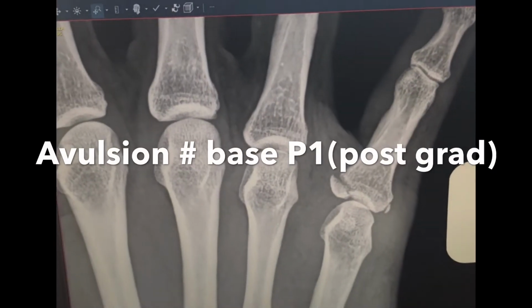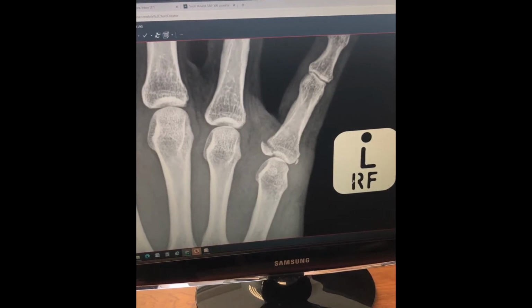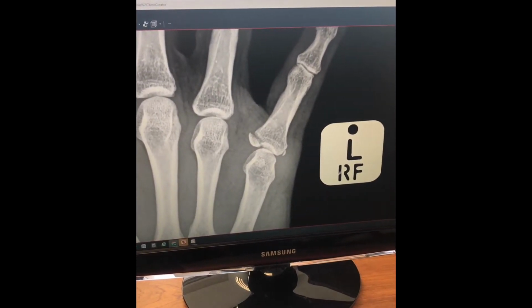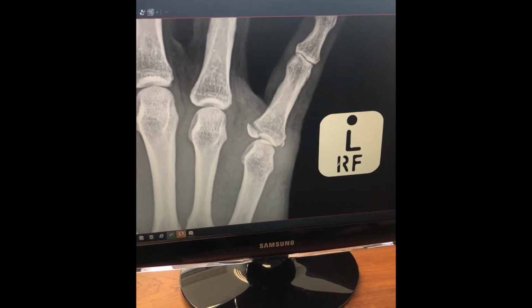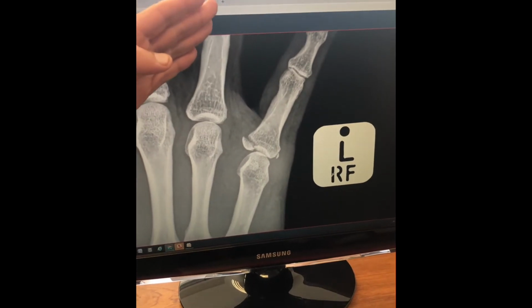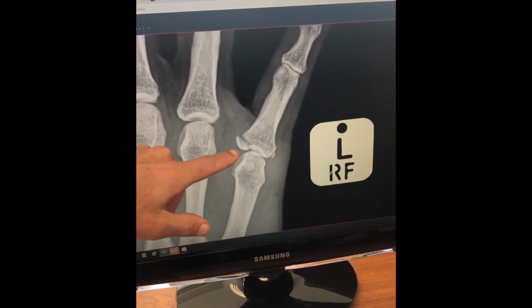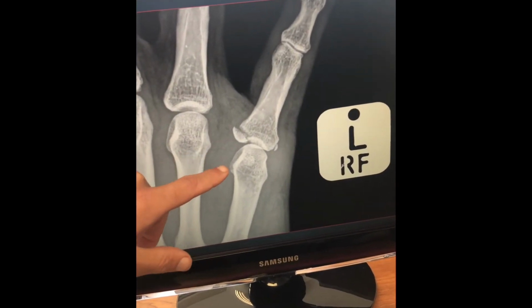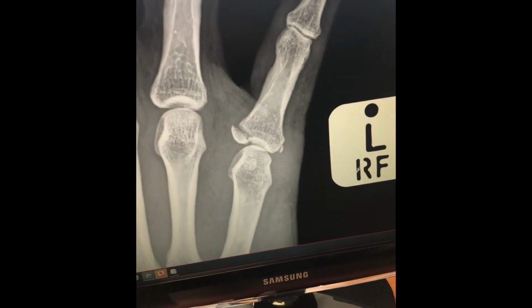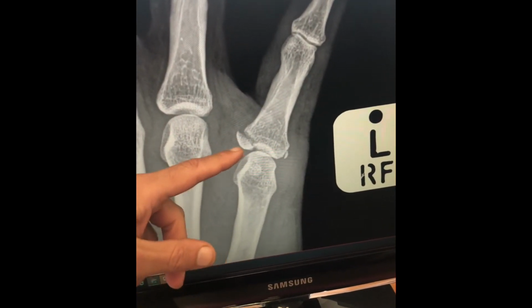Okay, so this is a 35-year-old lady who had an injury 6 weeks ago in a gym. Sorry, 4 weeks ago in a gym, and jammed the left little finger into the ground. So you can see clearly what's happened is that she has had an abduction injury and had an avulsion type fracture of the radial collateral ligament as it inserts into the base of the proximal phalanx. So at one stage, this proximal phalanx went all the way across, and now she sustained a fracture.